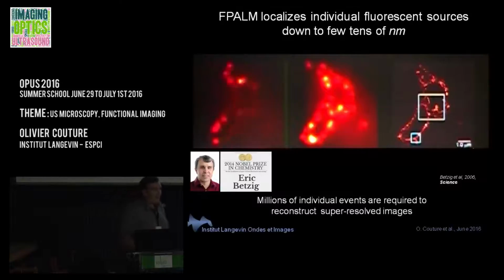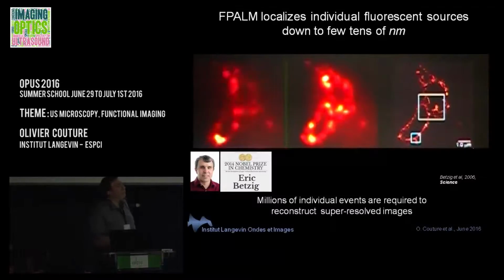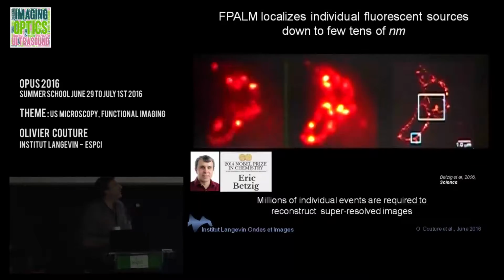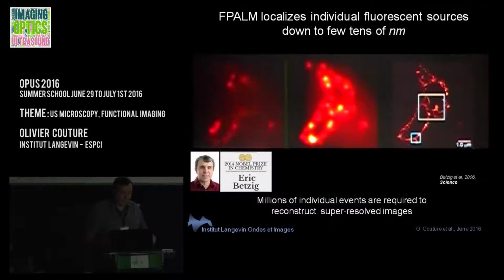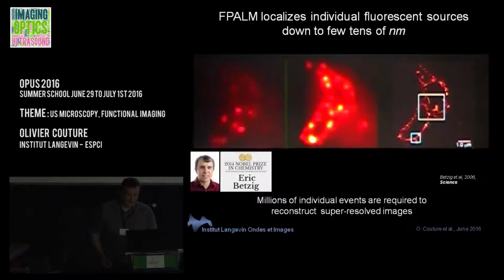Go to the subcell resolution. So in this case, you get from a few hundred nanometer in resolution in optics to a few nanometer to a few tens of nanometer. So you get a factor of 10 to 100 in resolution, and what we hope for is that we get the equivalent gain in ultrasound. But what I wanted to show you is the analogy between the two. In one case, you have ultrafast images with a contrast agent that blinks, and we have also a contrast agent that blinks under ultrafast imaging.